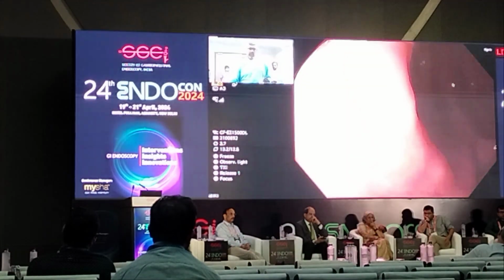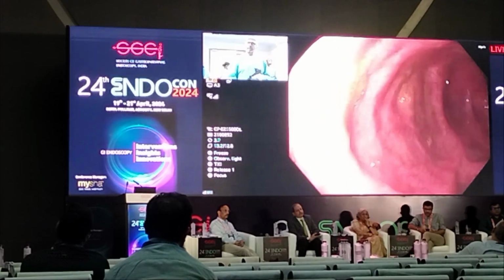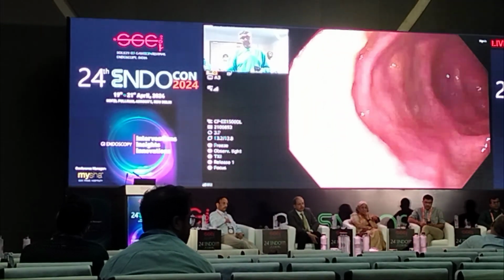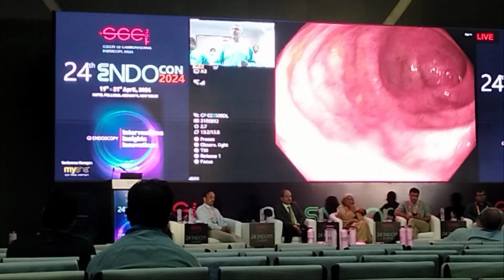With our AI modes that we now have on several of the scope platforms, SSAs I find are very difficult. The AI doesn't necessarily pick up SSA very well. So I think we are still reliant on optical diagnosis rather than AI.